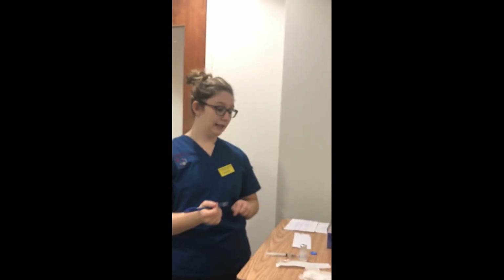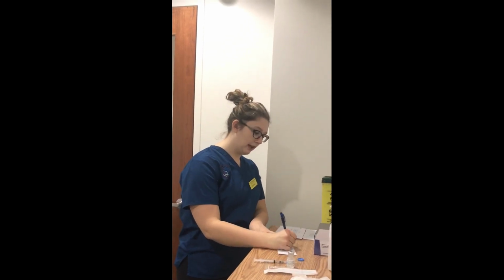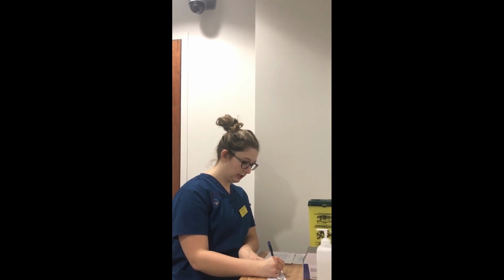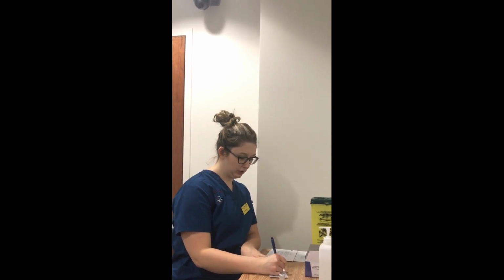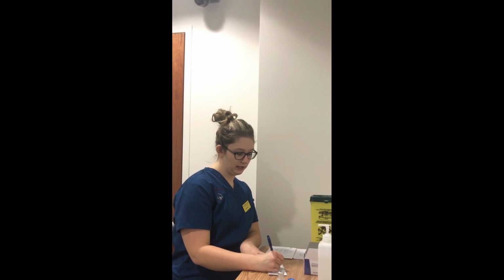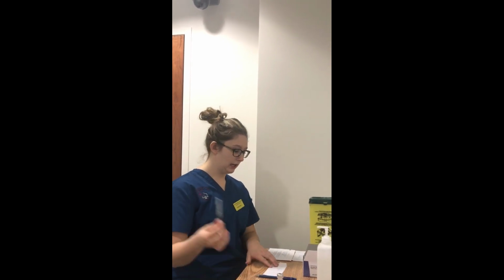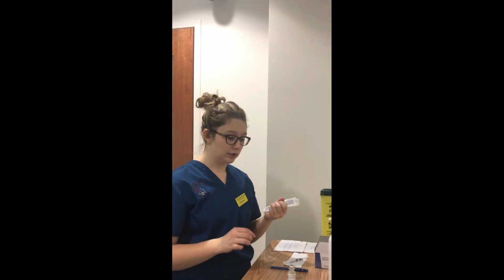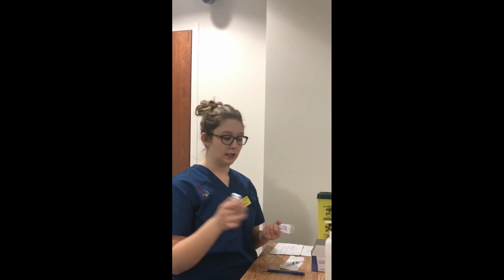And then I will write out the proper medication label. So I'm giving Haldol. The concentration is 4 milligrams per 2 ml, and it will be given intramuscularly. So then I will attach that to the syringe. Now that I'm done, I will throw away the lid to the vial. I will get rid of the plastic that the needle and syringe came in, and then I will put the Haldol back in the proper storage facility.